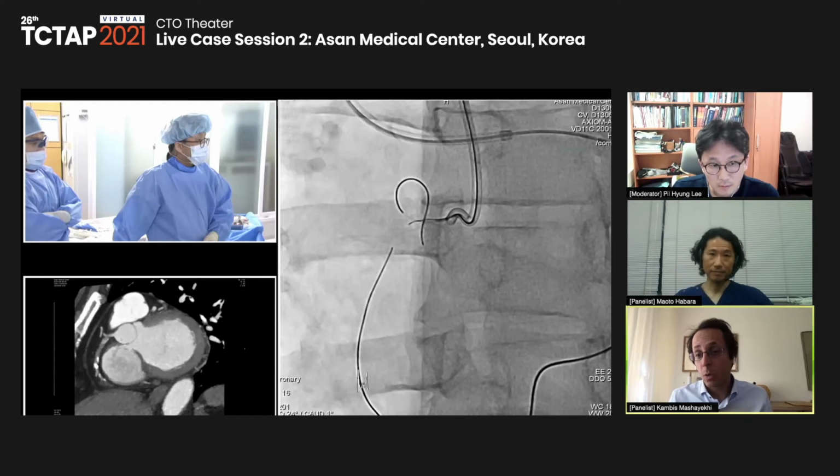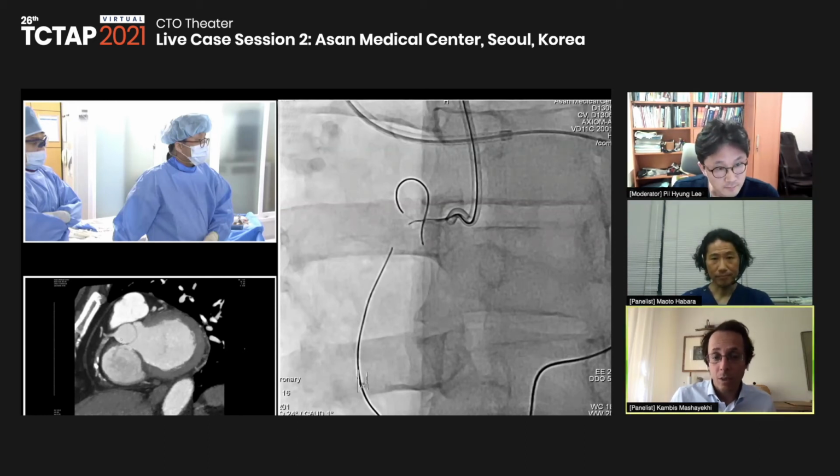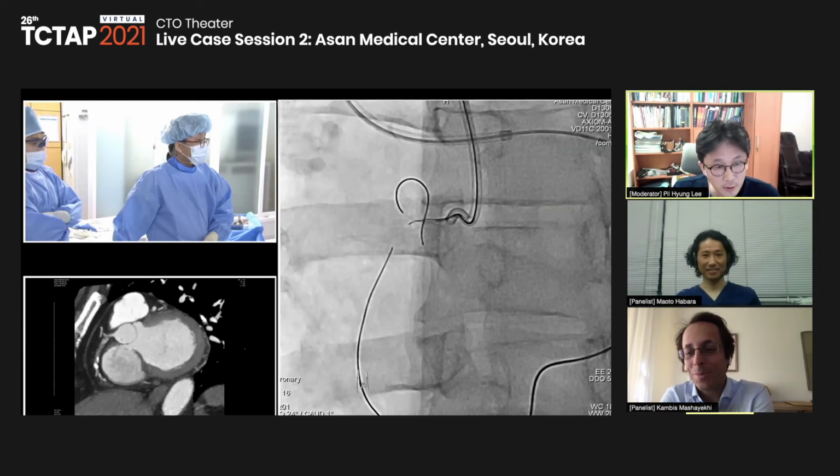Yeah. But now you can only go up with the microcatheter, and you have a really limited scenario now. Because the reverse CART is getting more complicated, you have kissing wire as an option now. And if you are able to do reverse CART or something, you have to do a tip-in or rendezvous, something, how to get the connection. So in the, let's say, in the catheter. So very interesting. Did you really have any experience using a balloon toward the epicardial?